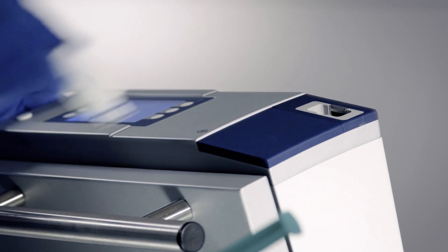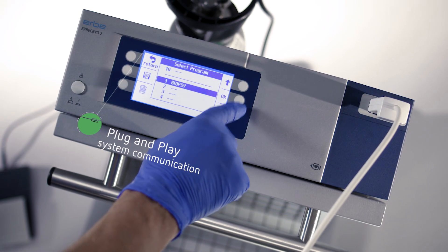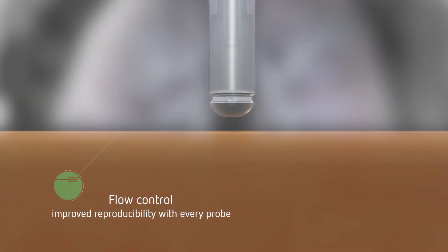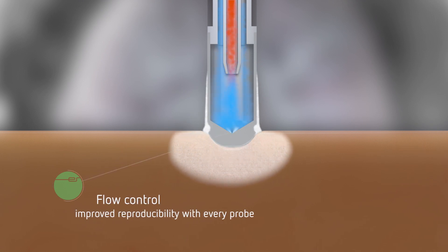Once connected, the cryoprobes are automatically recognized by the unit and the appropriate parameters are set. During activation, the flow control of the Herba Cryo 2 provides just as much gas as needed for the maximum freezing power of every probe size.